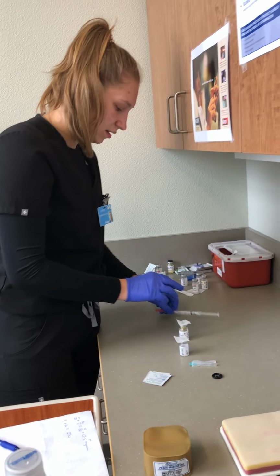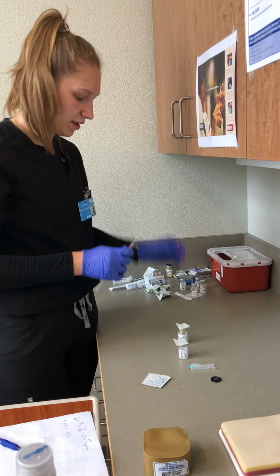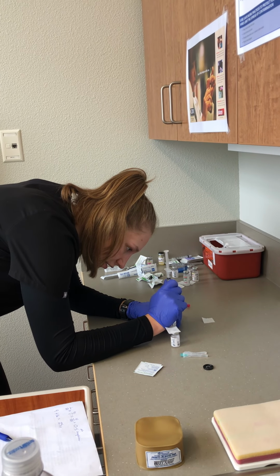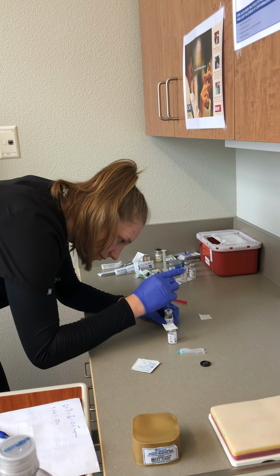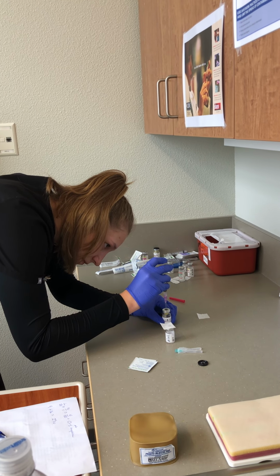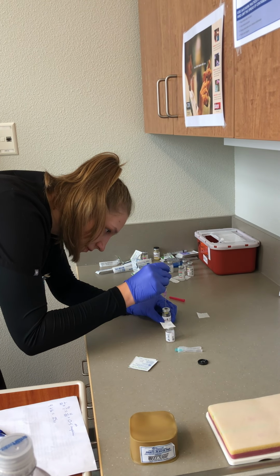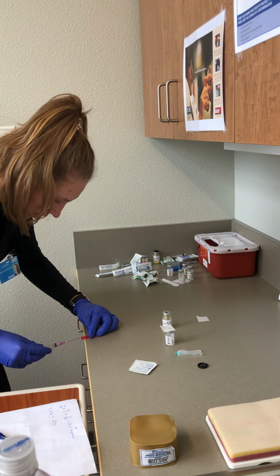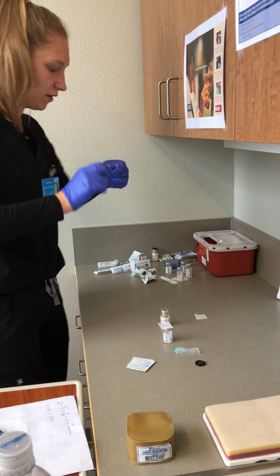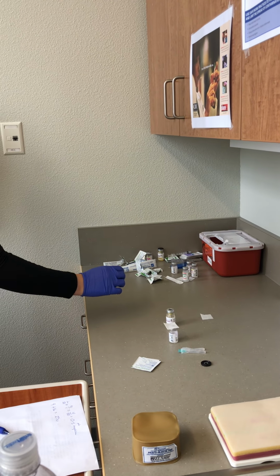Okay, I'm going to uncap this. I'm going to inject it in to my powder. I'm going to recap this. Remove my filter needle.